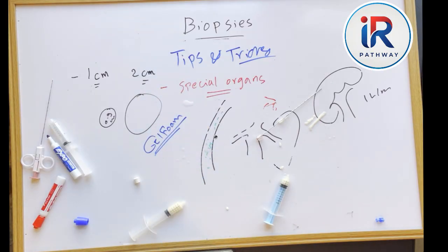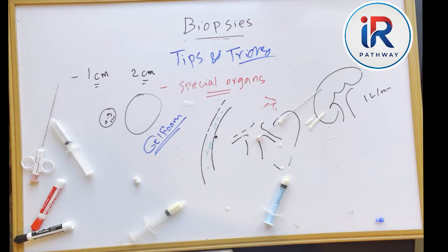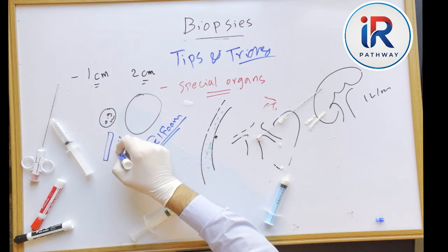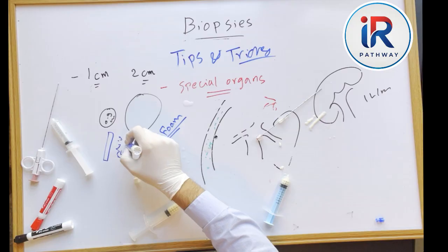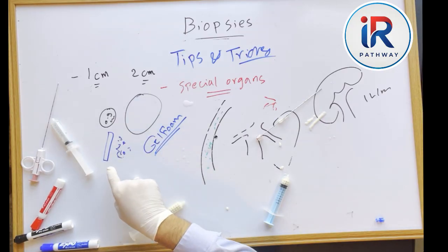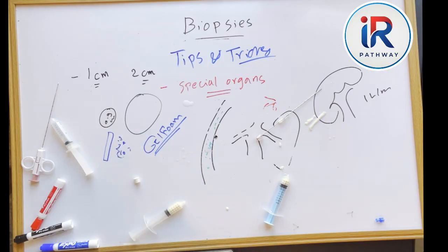The 1 centimeter sample is generally not preferred by pathologists for 2 reasons. First, it's simply shorter, okay, and provides less tissue than 2 centimeter sample. Second, which is a very important point, it tends to be fragmented. Pathologists usually prefer receiving one piece like this, okay? When the sample comes crumbled or fragmented, that's not ideal for the pathologist. That's why we always try to ensure that at least 2 out of 3 samples are intact like this.